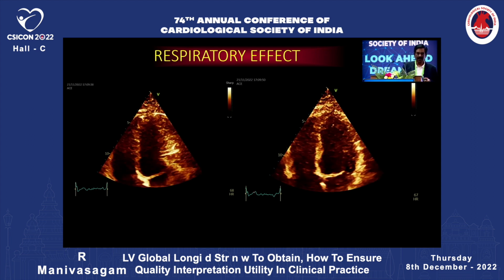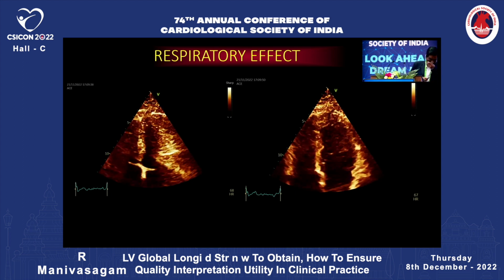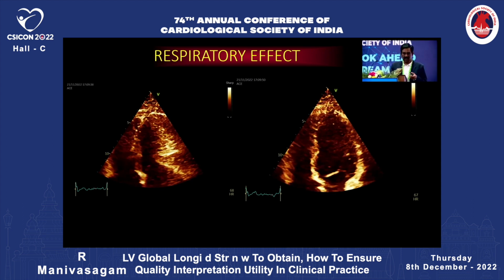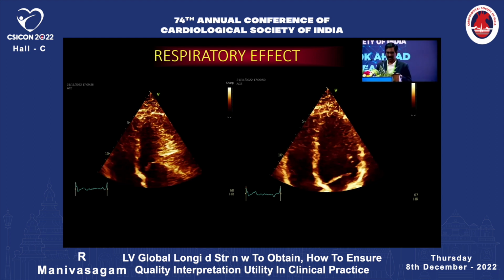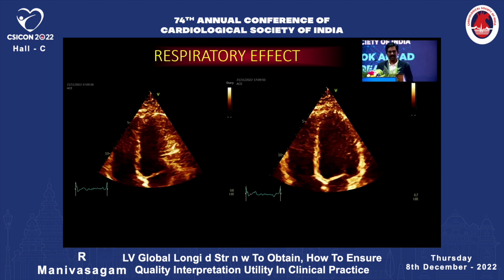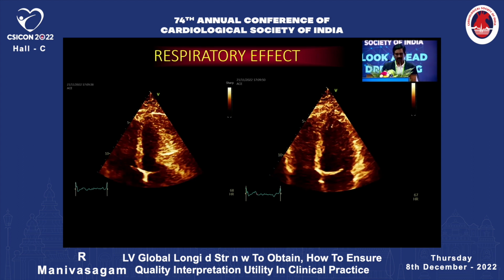Can I just interrupt you? Very good. Are you looking at the subendocardial strain, myocardial strain, or epicardial strain? It is because longitudinal fibers are situated in the subendocardium. Yeah, primarily, so we are looking at the subendocardial strain. So that's just to make sure of the point. Exactly, because the major portion of the longitudinal fibers are situated subendocardially. We are bothered about the subendocardium.